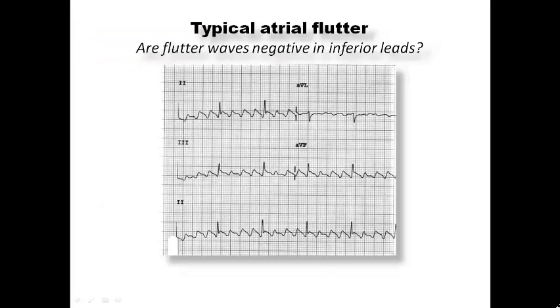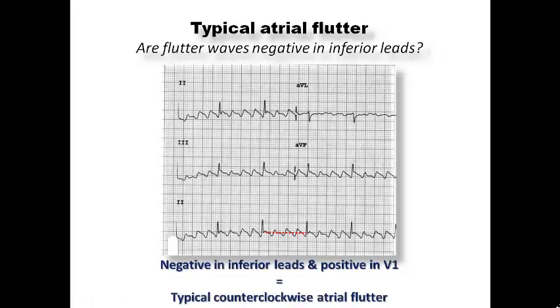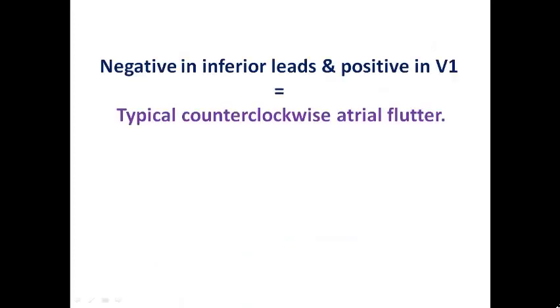To decide whether it is counterclockwise or clockwise atrial flutter, it depends on the polarity of the flutter waves in the inferior leads and V1. If the flutter waves are negative in inferior leads and positive in V1, this represents typical counterclockwise atrial flutter, which is the most common pattern.